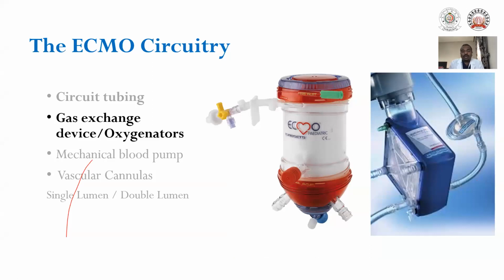The next important accessory, or part of the device, is the oxygenator. It is also called a membrane oxygenator. It is a device used to add oxygen and remove carbon dioxide. Though it is called only an oxygenator, the function is not only oxygenation, it is also going to remove the carbon dioxide from the blood.